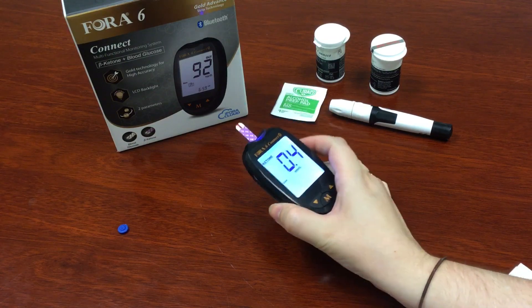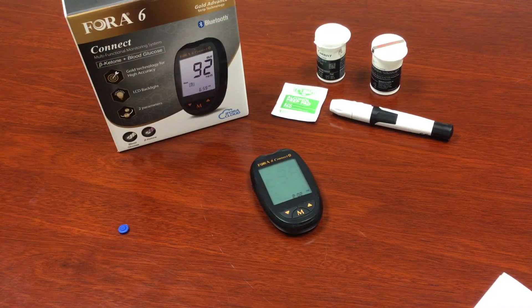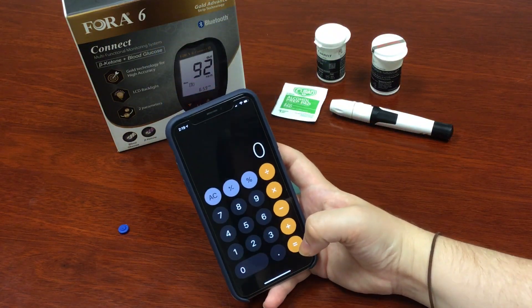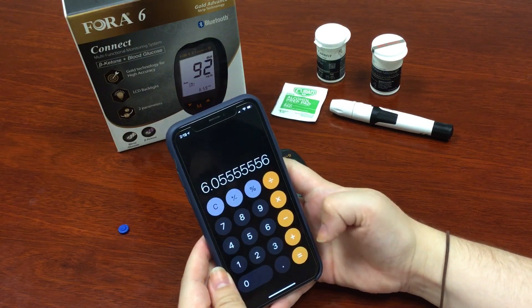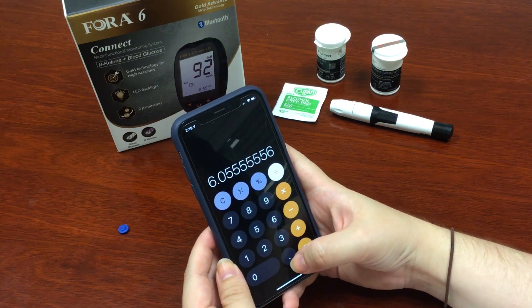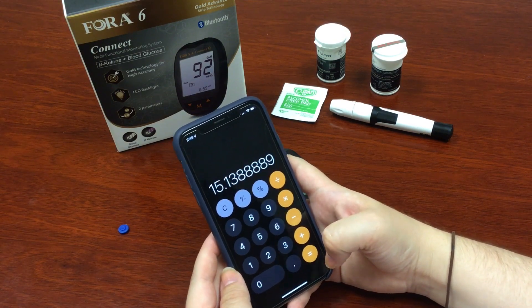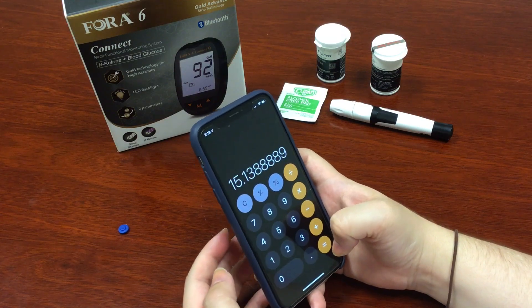Write that down because you're going to need it for your GKI calculation. Now that we have both glucose and ketone levels, we can calculate GKI. Grab your calculator. Divide your glucose number by 18 if you're in the U.S., and then divide that number by your ketone number that you got earlier. And now you have your GKI. This will provide a better picture of your overall health than a single ketone measurement.